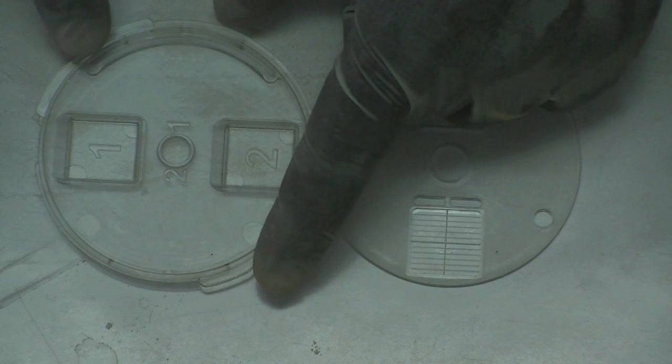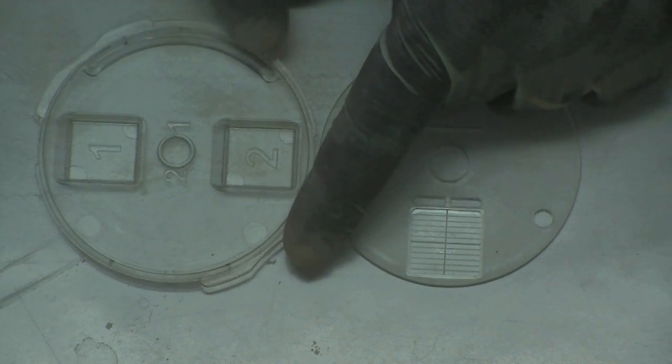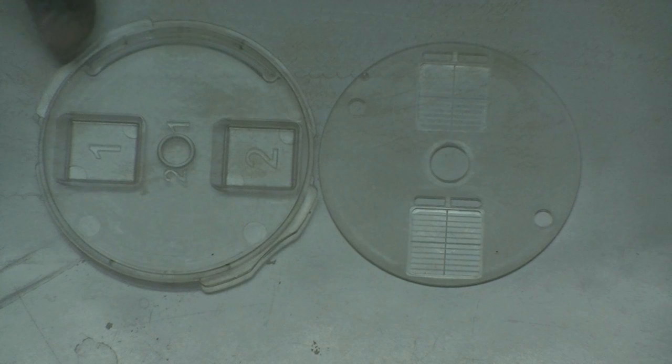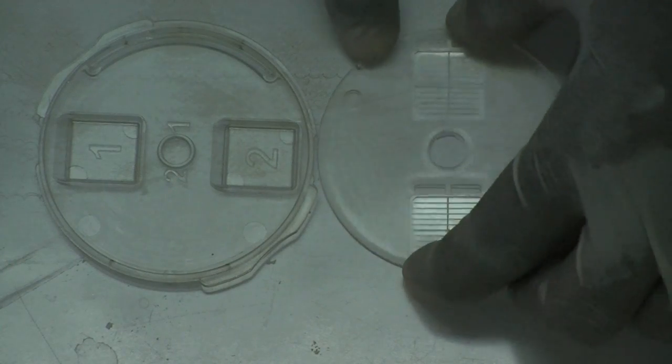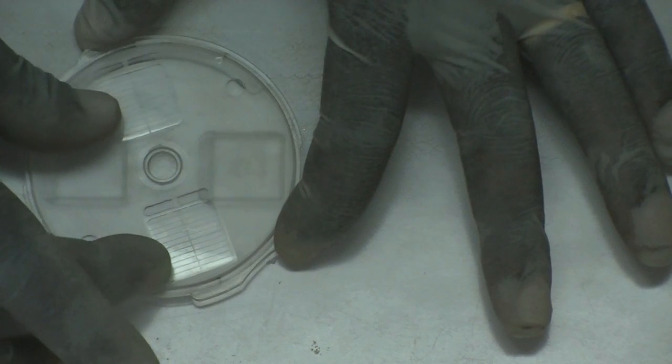We will first assemble the base and the disc. At the top of the base you find a groove. At the bottom of the disc you see a protrusion. Put the disc on the base so that the protrusion fits into the groove. You should now be able to turn the disc.